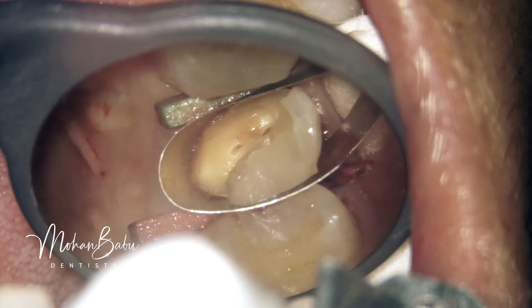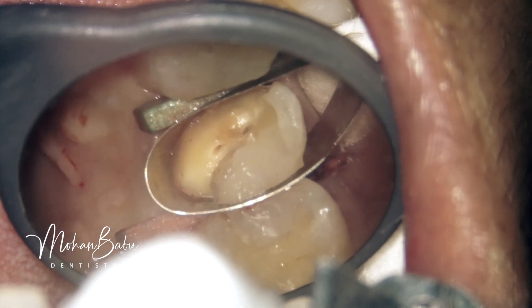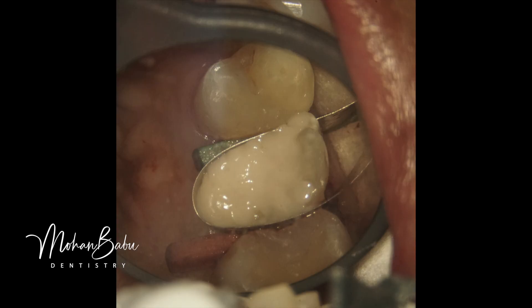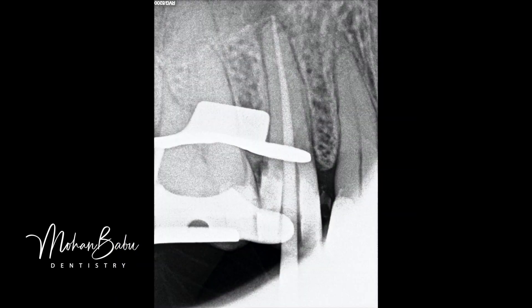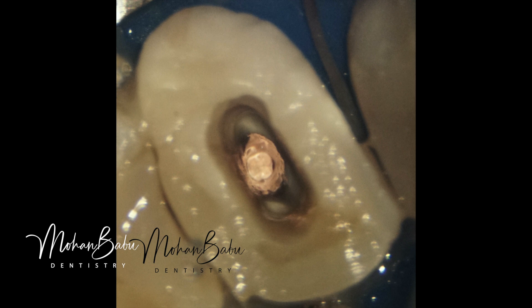With the isolation achieved, we proceeded to do a GIC pre-endo buildup. Once the GIC pre-endo buildup was done, we applied the rubber dam in a regular manner. Root canal treatment was started through the GIC pre-endo buildup, and the root canal treatment is now completed. You can see the down-pack of gutta-percha, and the remaining part of the canal is prepared for post placement.